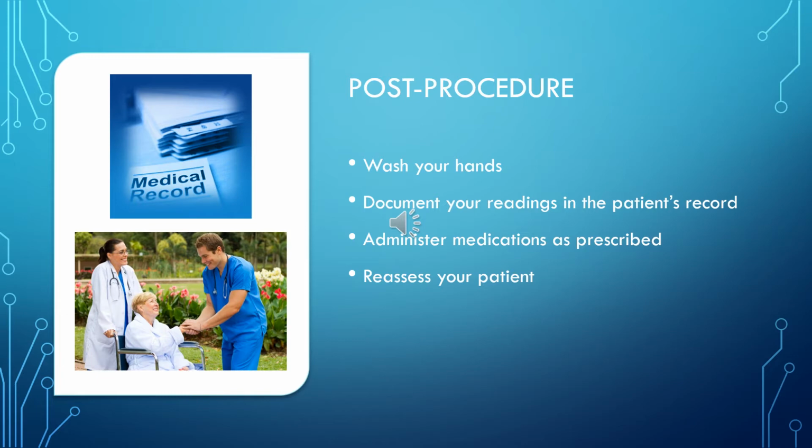So in this case, we're going to do the same thing. We will ask our patient how they're doing, make sure they're no longer bleeding from the puncture site, and offer comfort to them as needed. At the same time, you can share your readings with them and discuss the treatment plan based on the reading that you received.